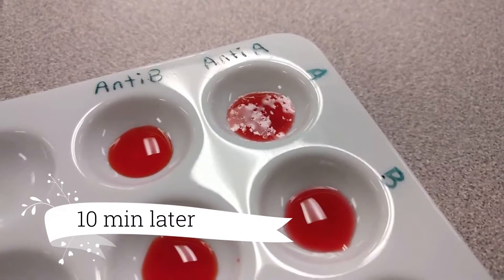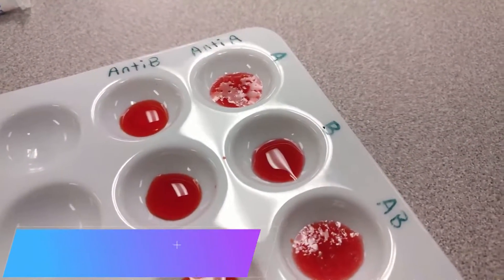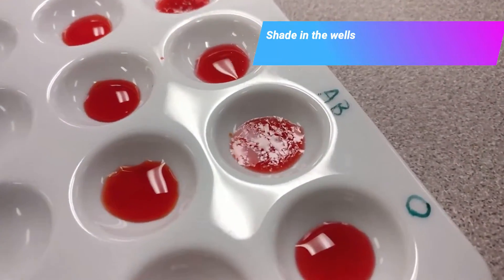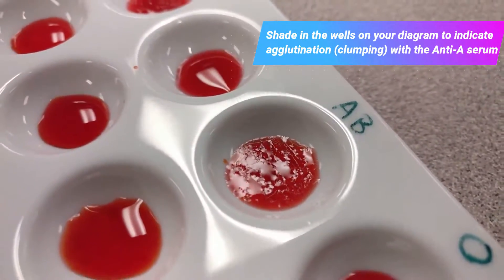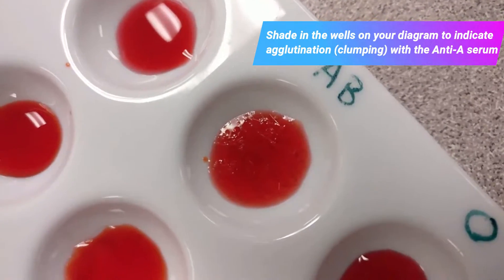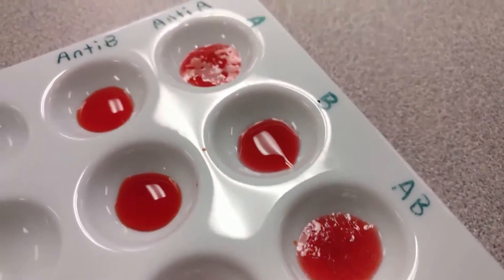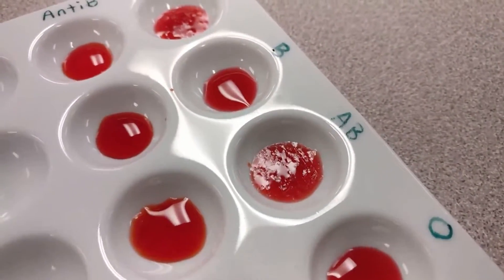We are back — it has been 10 minutes. I'm showing you these at an angle because it is easier to see if agglutination or clumping has occurred in each of these wells. You can see clearly the A and the AB sample have a significant amount of clumping occurring, and you can see that reflected in the light. If I hover over it, you can see thin lines on the bottom of the well as well, whereas B and O do not have any clumping.